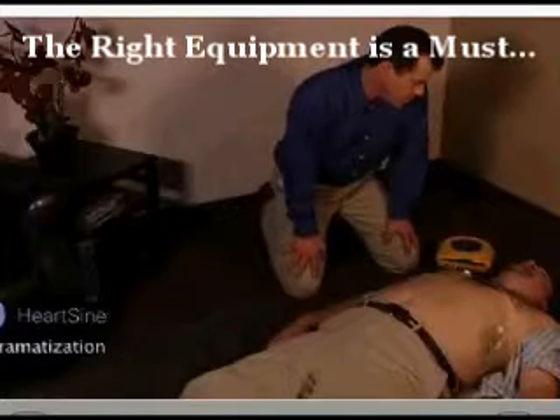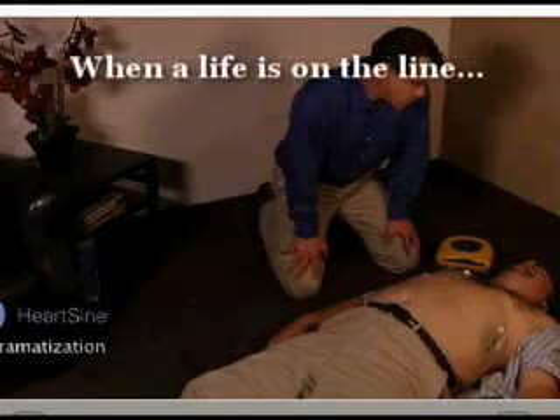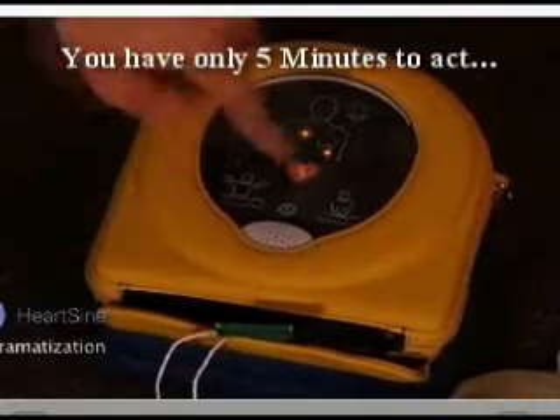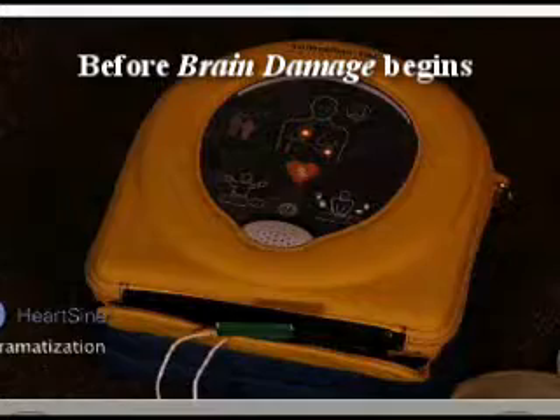The Samaritan PAD automatically assesses the patient's heart rhythm and recommends whether or not a shock should be delivered. Assessing heart rhythm. Do not touch the patient. Shock advised. Stand clear of patient. Press the shock button now. Clear. Shock delivered.